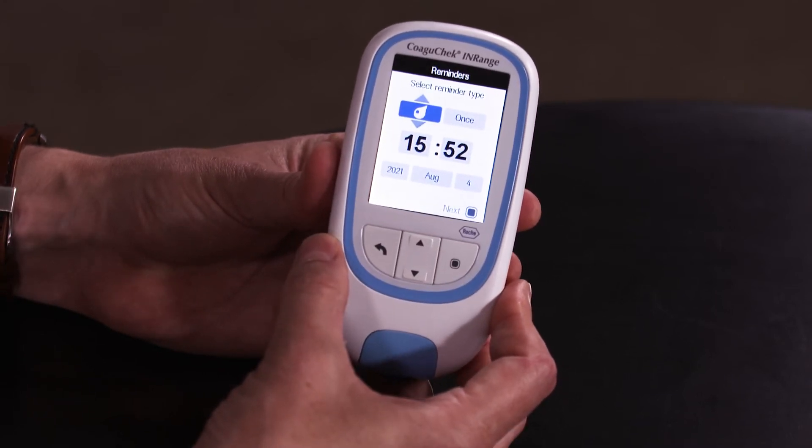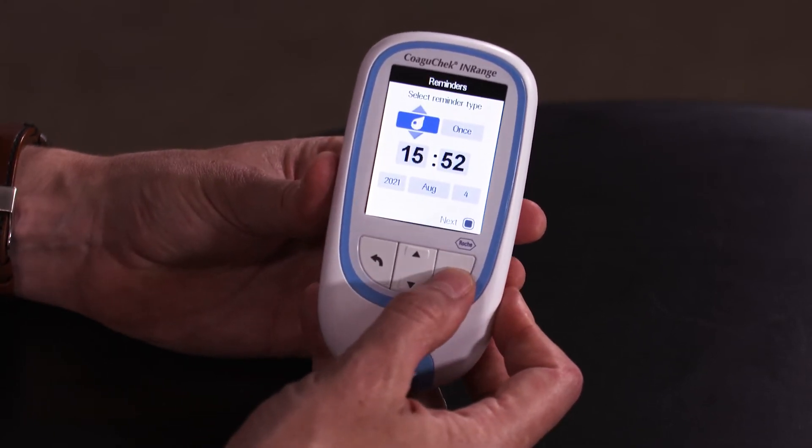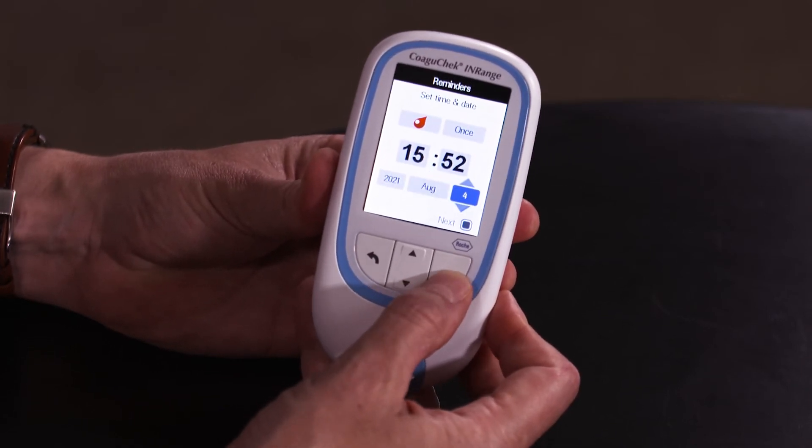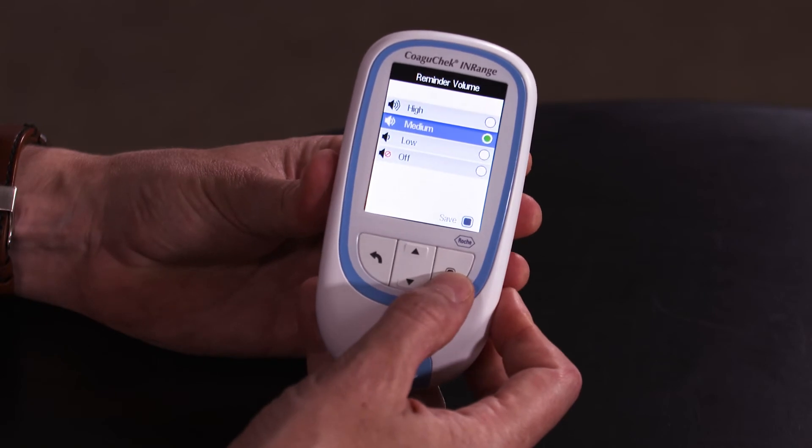Select the correct reminder and confirm time, date and frequency, and then save.